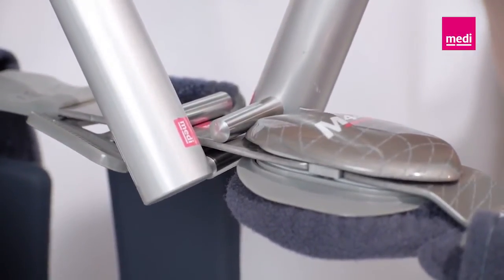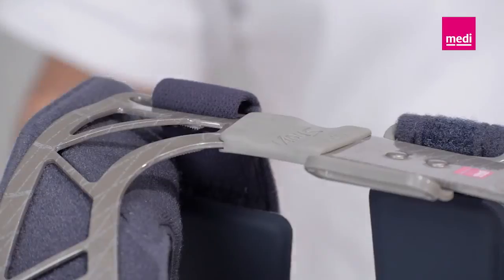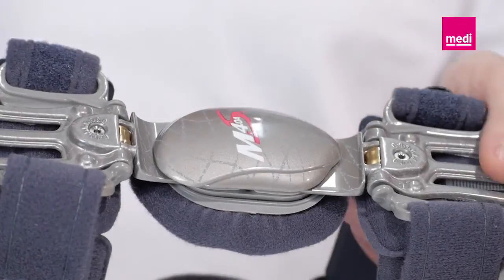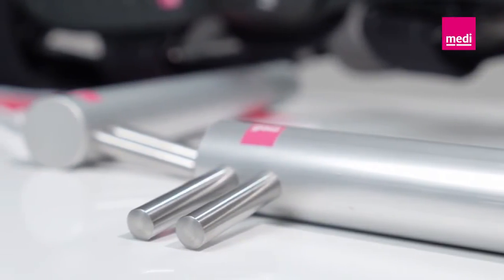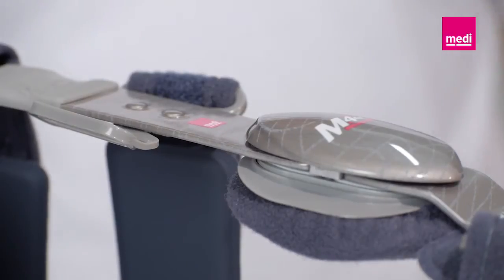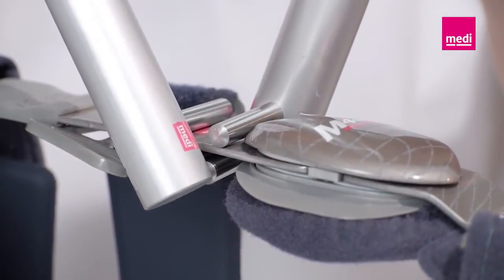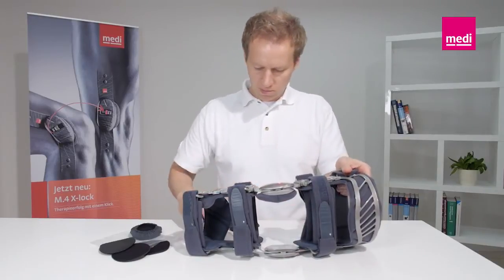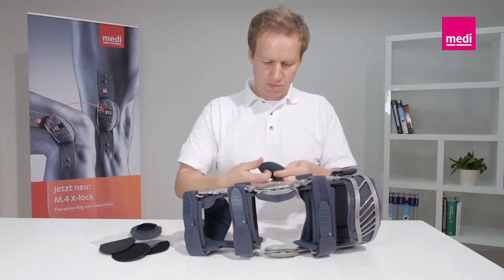The closer you set the bending tools together, the more acutely the orthosis frame bends. It is best to avoid any bending in the region of the shims under the covers. The M4SOA cannot be bent on the side with the adjustable hinges. Always use rounded bending tools to avoid damaging the frame. Remember that a closed system like a rigid frame brace can only be bent a certain amount. Mold the orthosis in small increments to match the contour of the leg and avoid overcorrection. Replaceable pads can also be used on the medial sides, guaranteeing that the orthosis fits perfectly even on very thin knees or when swelling varies.